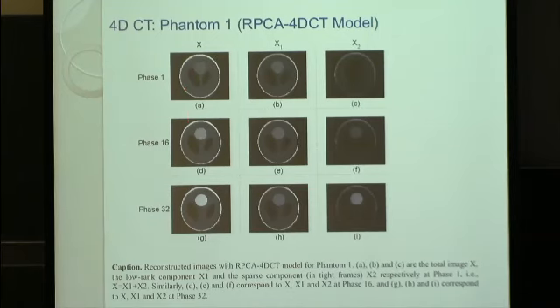If you want to look at the denoised image, this is this. If you look at the low rank part, that's the low rank part. If you want to look at the change, intensity change, motion, and so on, intensity change is captured here. The motion, as I said, part of it can go to the sparsity part. The symmetric differences could go to the sparse part.